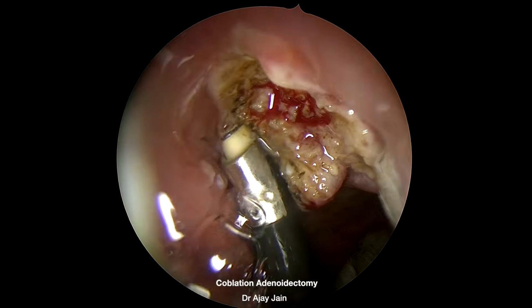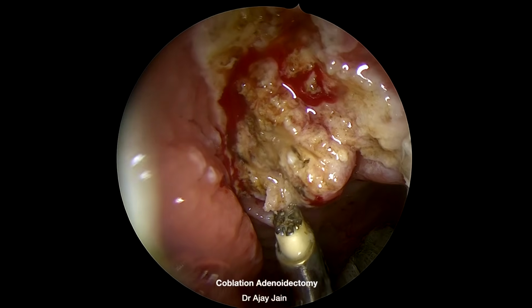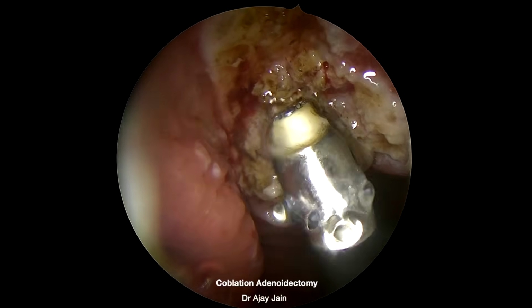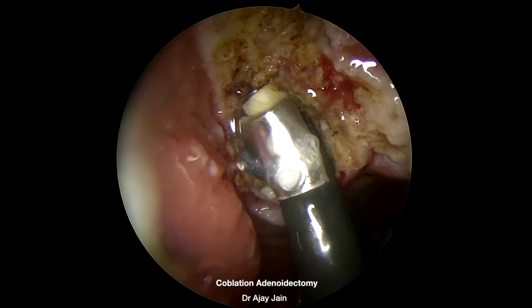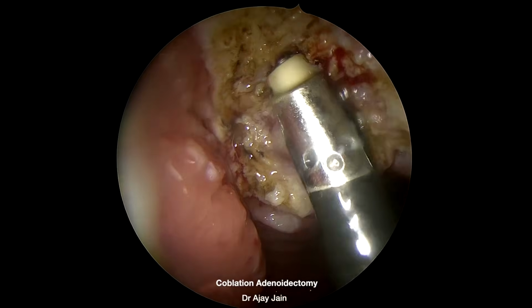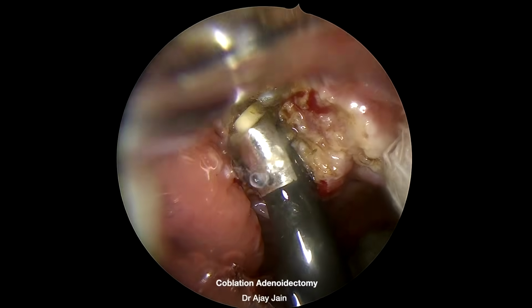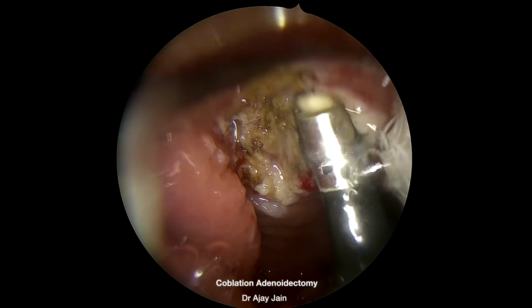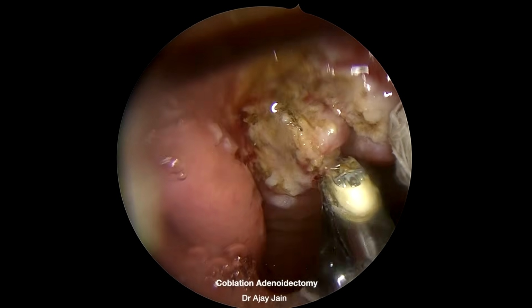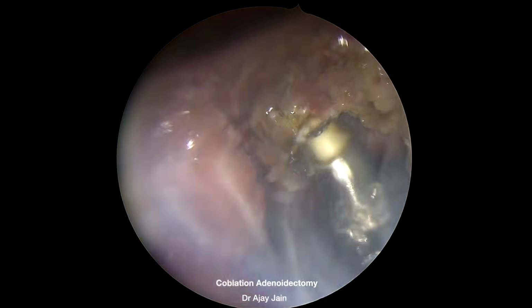See, this was the last layer towards the fossa of Rosenmuller. I am coming now from lateral to medial. Lateral side you can see the depth. Medially it's less, but you can go the other way around as well. So hardly there is any charring. All tissues are white, continuous irrigation, proper light, and see, I have not removed my endoscope so far.